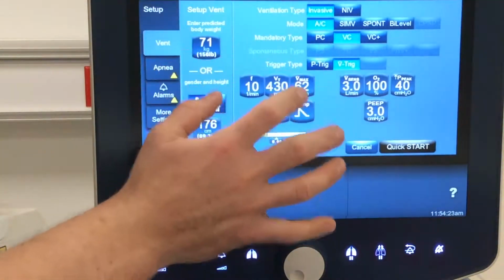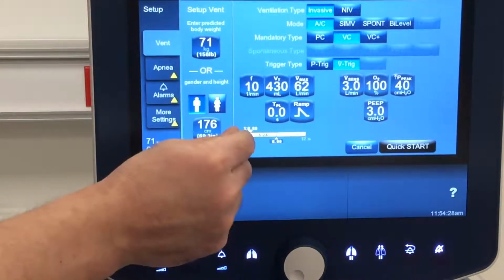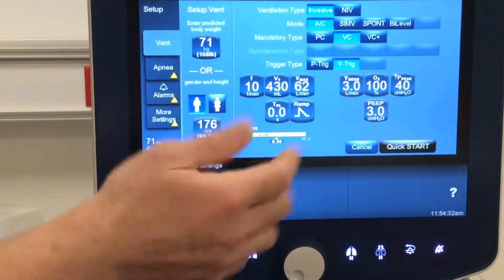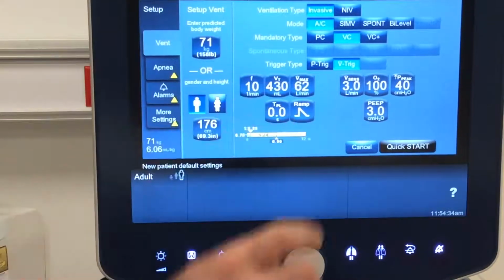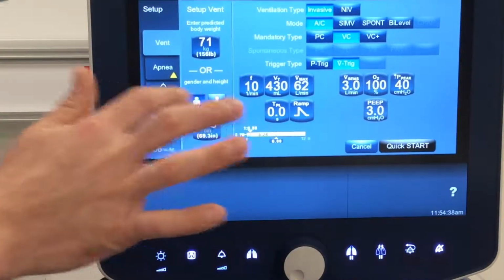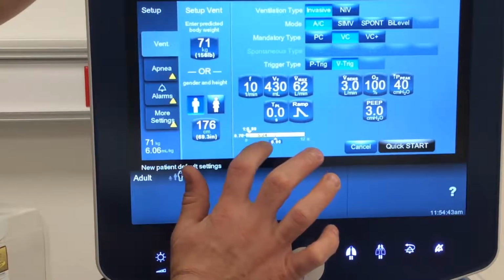One of the hallmark things of assist control, regardless of whether it is pressure or volume, is we are directly fixing inspiratory time. Shouldn't say directly. We're fixing inspiratory time. It's locked, okay? It doesn't change. In this case, we'll talk about what is actually setting the inspiratory time here in a second. But it's important to make sure that we realize that.